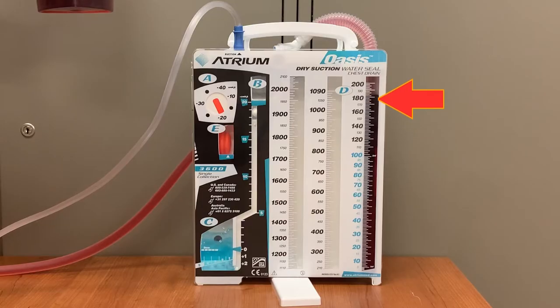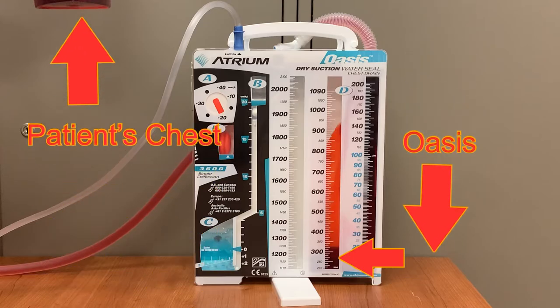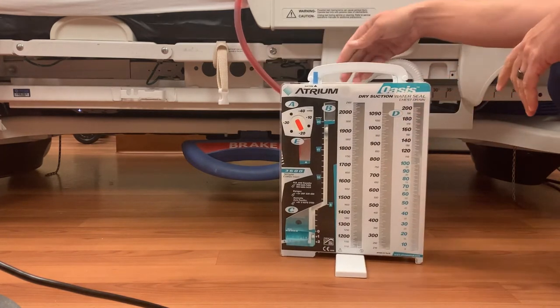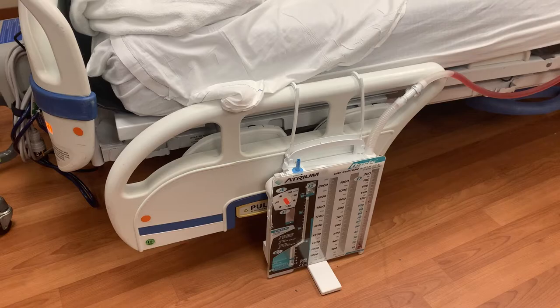Drained fluid first fills the rightmost column and then moves to the center column. To ensure that the chest tube can always drain, the Oasis must be placed below the patient. It can be placed on the floor next to the bed if you utilize the stabilizing stand on the unit, or it can be hung from the bed itself with the attached hooks. With the bed in low position and the side rail down, attach the hooks to the rail and engage the stand, as the unit will lightly rest on the floor at this height, making it less likely to be accidentally knocked over.